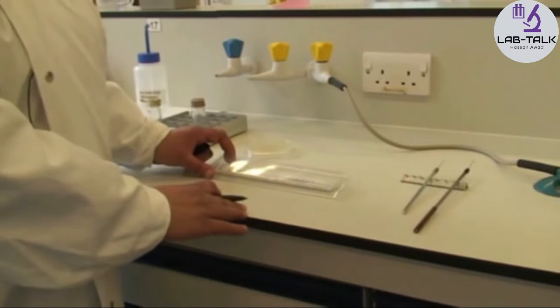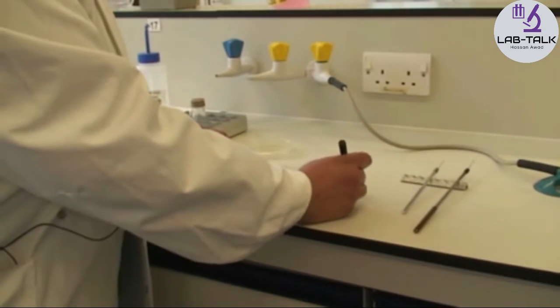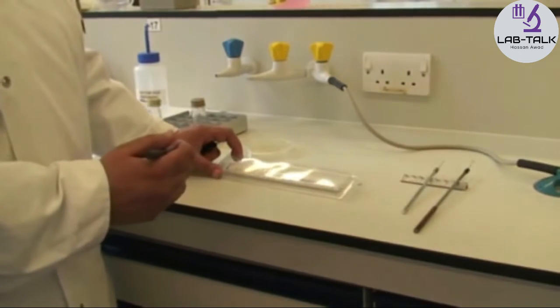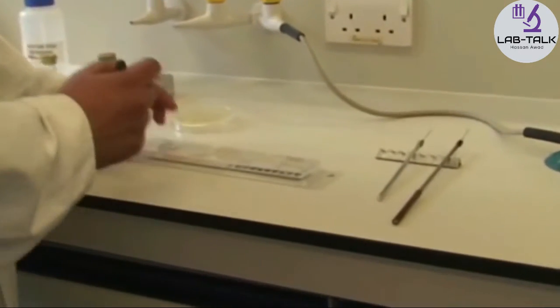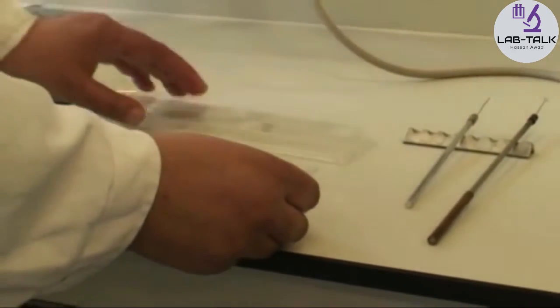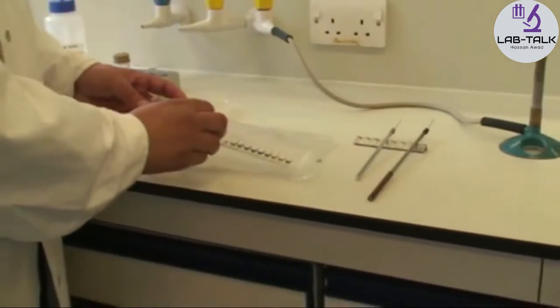First, label the API strip with the unknown organism in the right-hand corner. Then take the lid off and look at the base of the well.